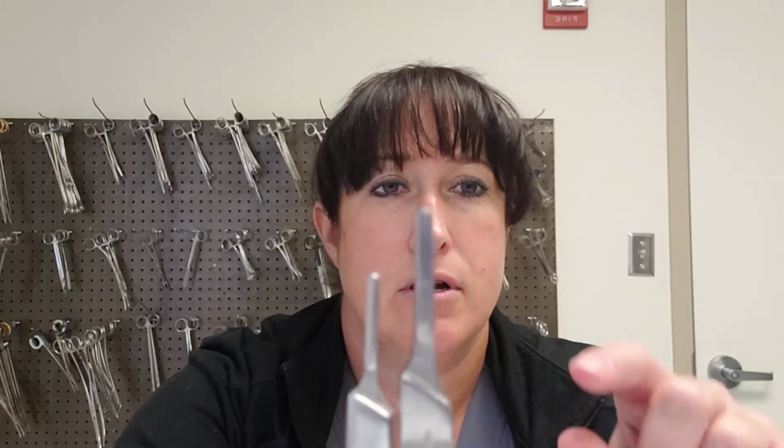The next scalpel handle I'm going to show you is this number 4. It looks pretty similar to the 3, right? To an untrained eye, these are going to look the same. But to a trained eye, you're going to realize that one is actually a lot bigger than the other. This number 4, it's wide. This top part is wider and longer. So there's actually one blade that will fit on that I'm aware of, or that we're going to learn, and that's the number 20.